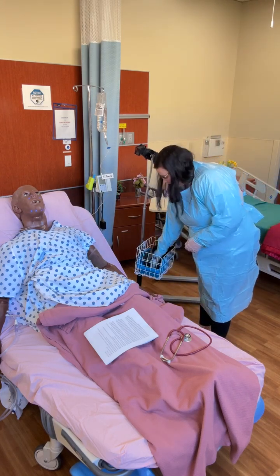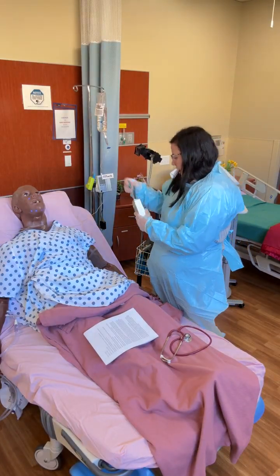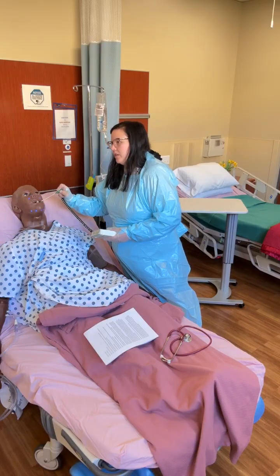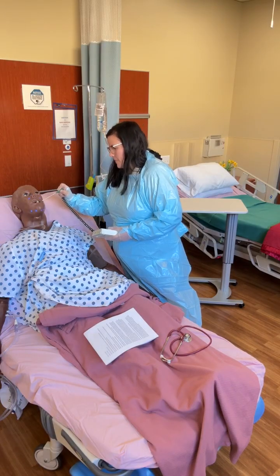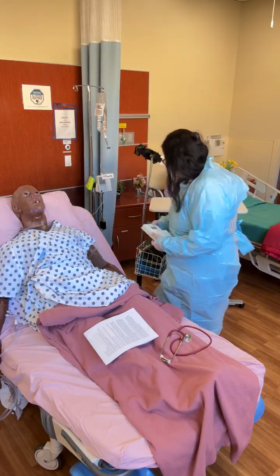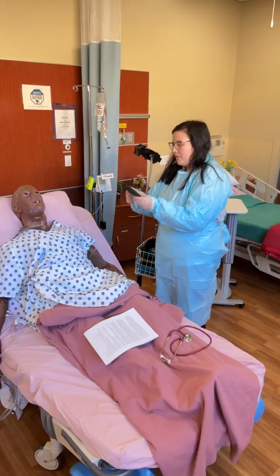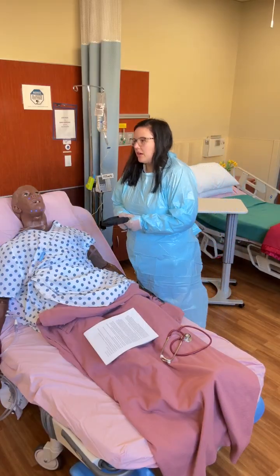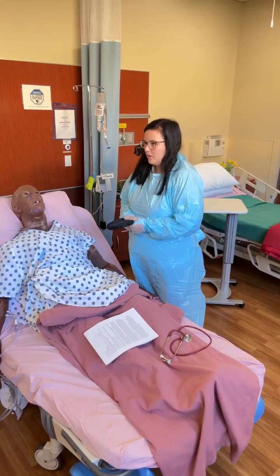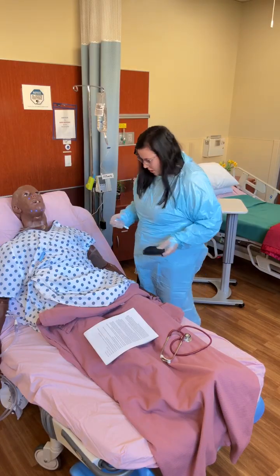And next up we have temperature. All right, Stan, I'm going to have you say ah so I can get your temperature. And what's my temperature? Temperature is 99.8. 99.8. My partner wrote that up there for me. I have my blood glucose monitor out. Sim question, what is my blood sugar? Your blood sugar is 120. 120. They wrote that for me.